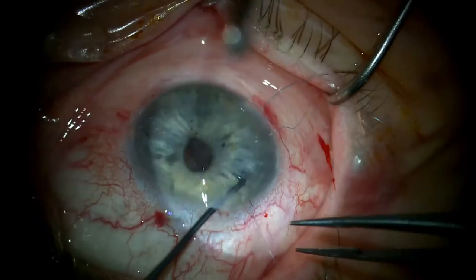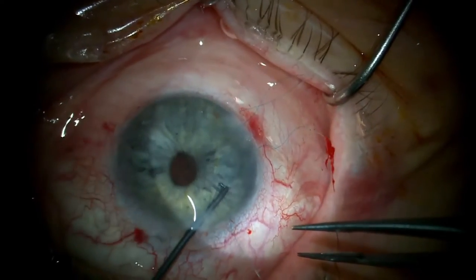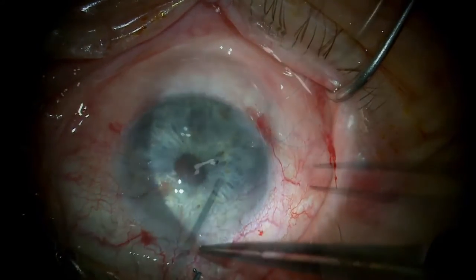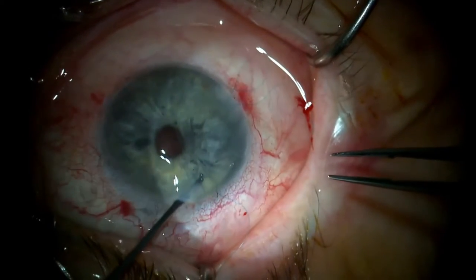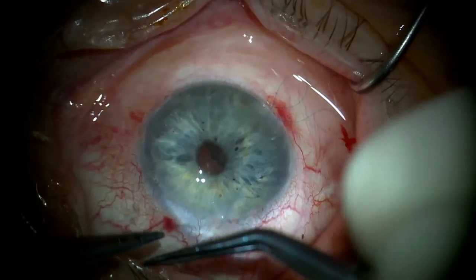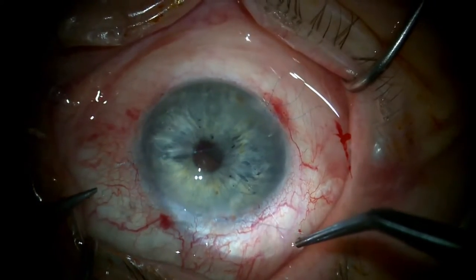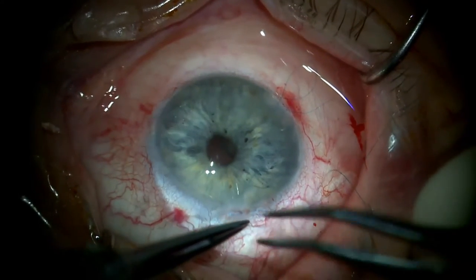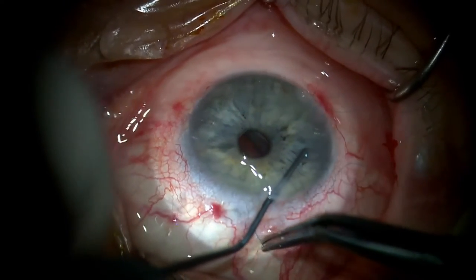The microscope has been rotated to make it easier to retrieve the first suture arm of the second haptic out through a different paracentesis, and then retrieve the second arm in the same fashion. The two-wrap throw is created and the throw is tightened to the outside of the paracentesis with the formation of a longer loop as both arms are held by one tying forcep. The throw is then cinched inside the eye as was done for the first haptic.